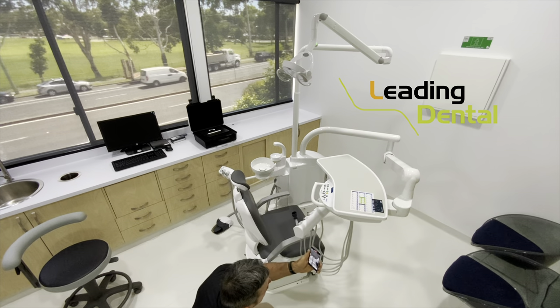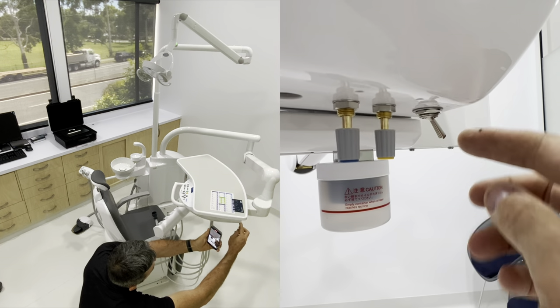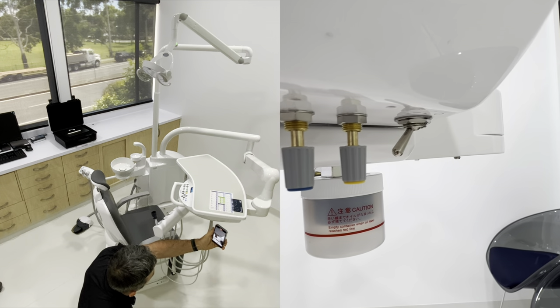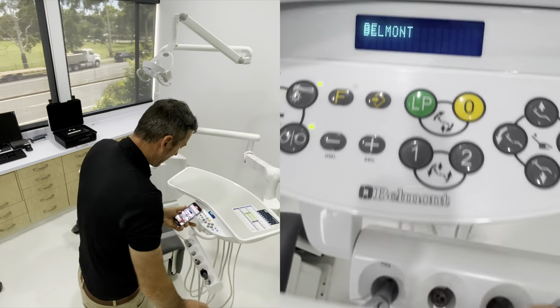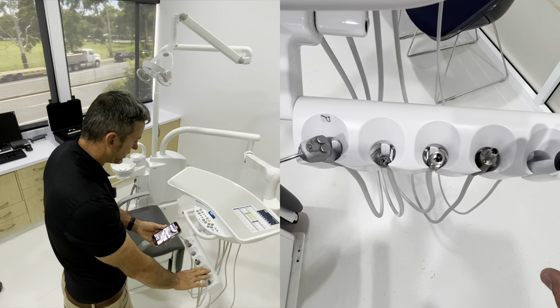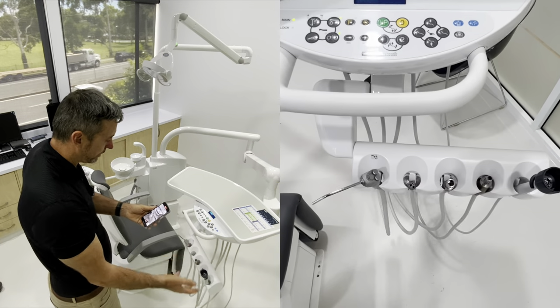We're going to start under here in the doctor's tray. That's where we're going to start every morning - we're going to turn this on and off. It's a little switch here, but you can hear the air gushing out and then the line there is forward. You'll see our little display panel lights up there when it starts up. Now just be aware, make sure all of your hangers are in place when you do start the chair up, or it will lock out the hangers. So make sure it's done its full boot-up before you pull anything out.